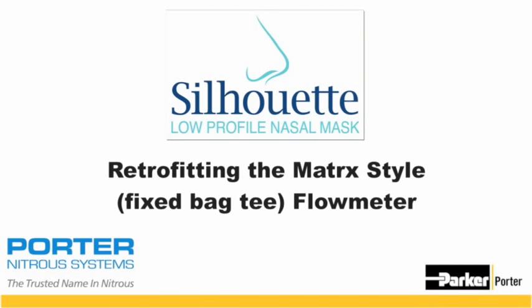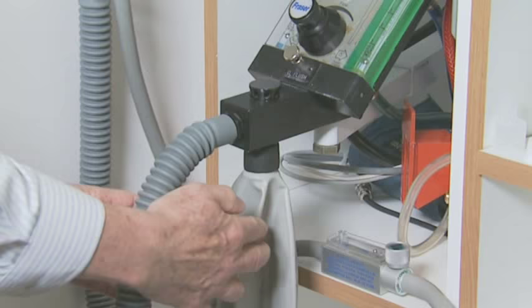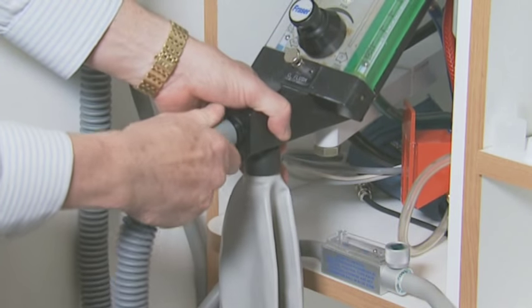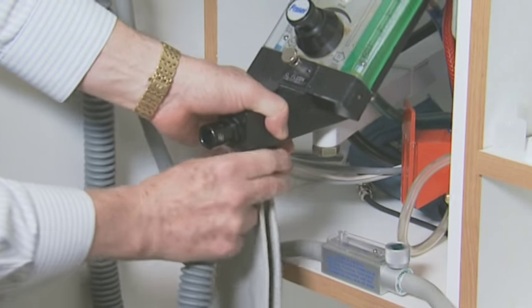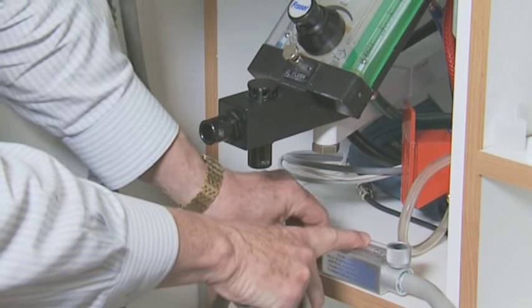We're ready to demonstrate how the Silhouette Mask system can be added to a matrix flow meter system. There is a breathing tube, a breathing bag, and a vacuum tube. We must remove those and the vacuum tube.